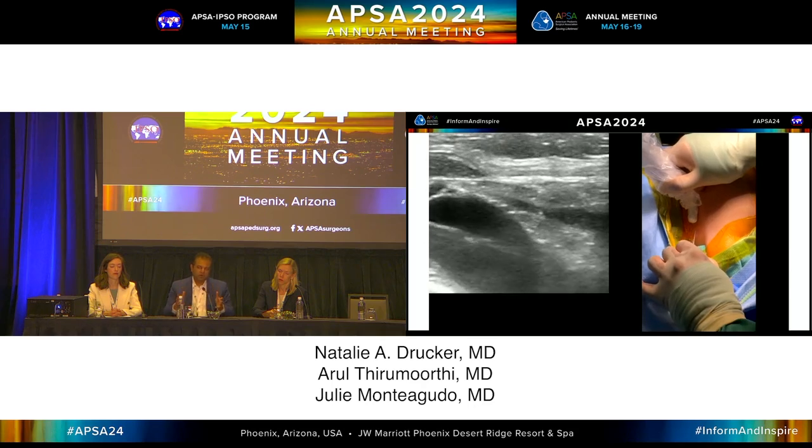And only if I do all those things have I been successful in these really small children. Any other shortcut of trying to just get it in, I just push, the needle pushes right out.